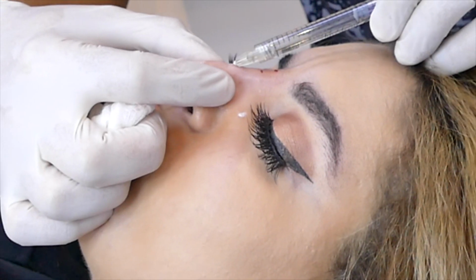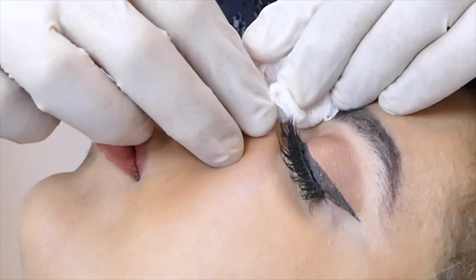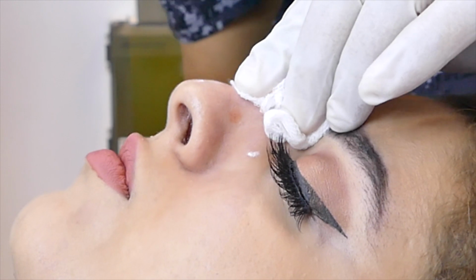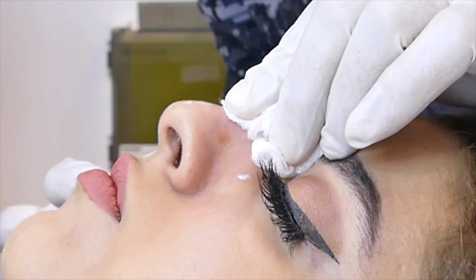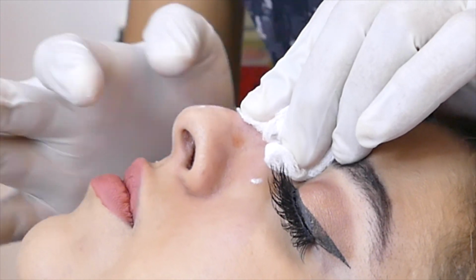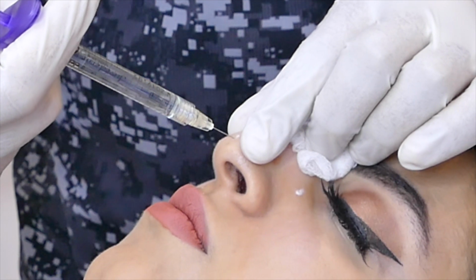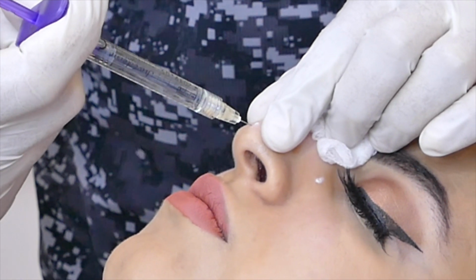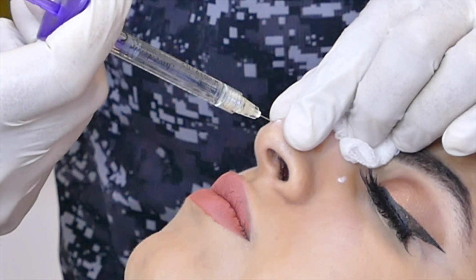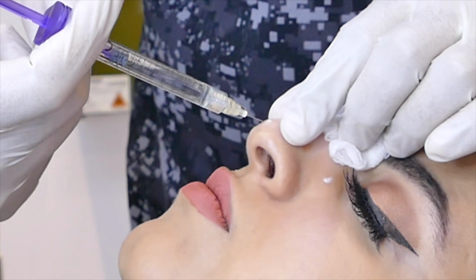Then I will inject below the hump, again remaining in the center of the nose, which is a safe zone. Remember, the dorsal nasal artery is on either side of the midline, and it is in the SMAS layer. So if you go deep over the perichondrium, you are in the safe zone. Then I am injecting the tip area to the new tip defining point.